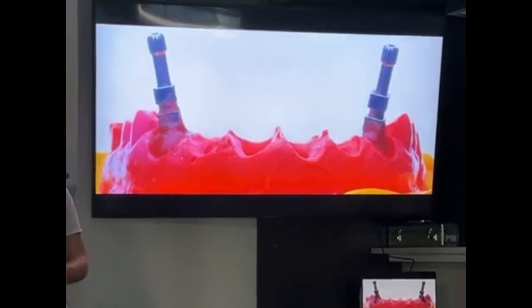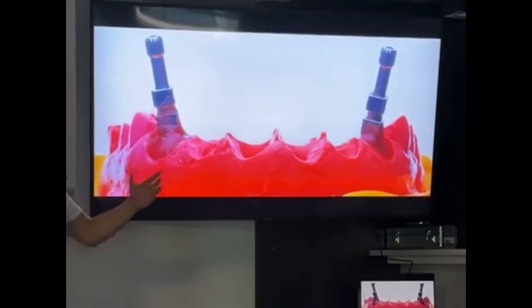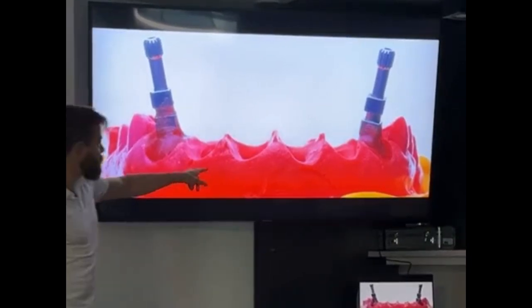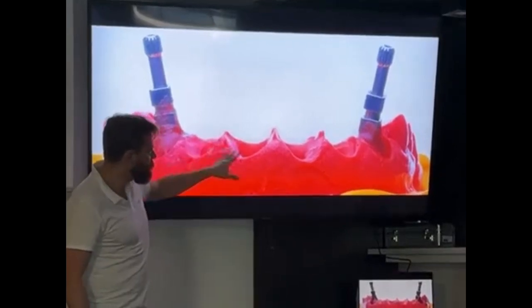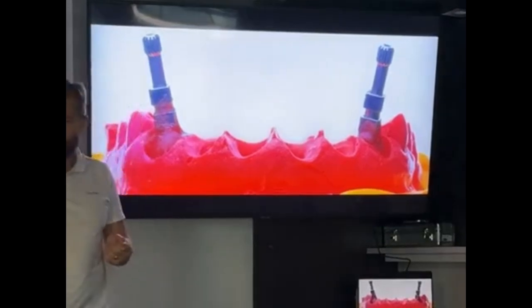The nice part is that the patient is taking a nap, you are working on the cast, listening to some music, relaxed, because this is an easy job. It's nice for you to do that. You see the zenith position, triangular shape, from here, concave. This is going to be the base for me to modify the provisional.